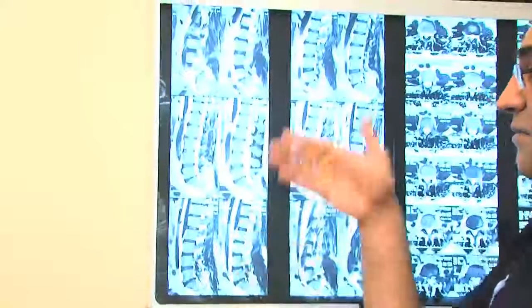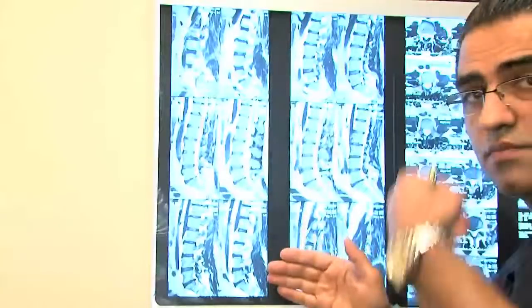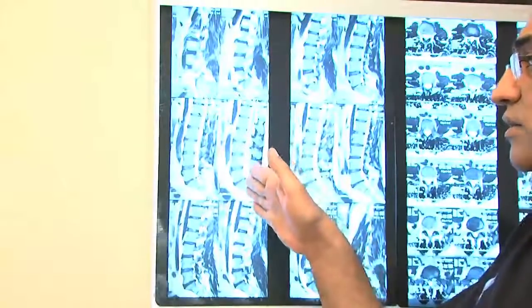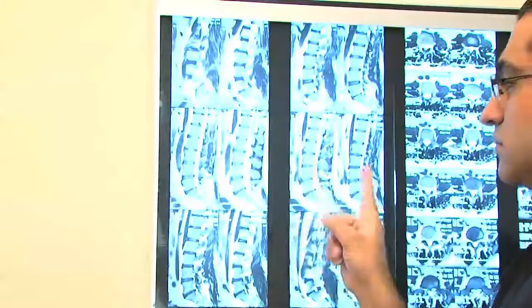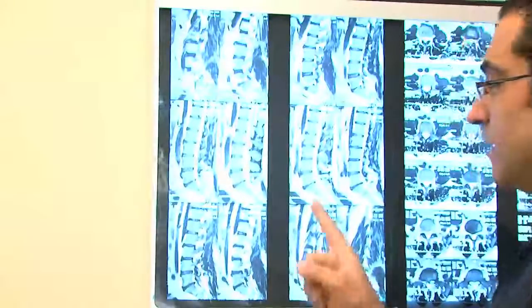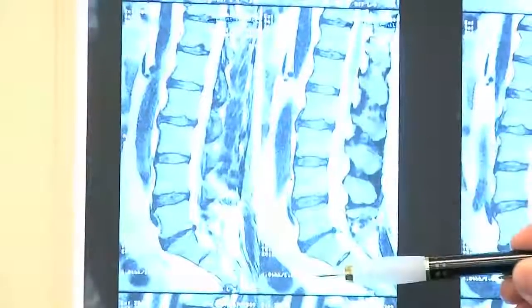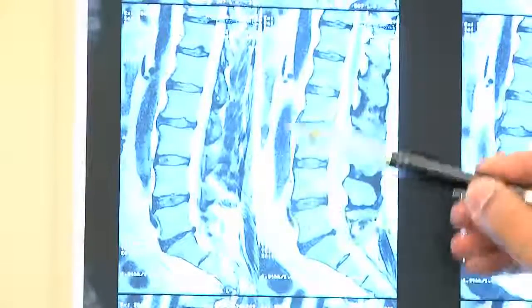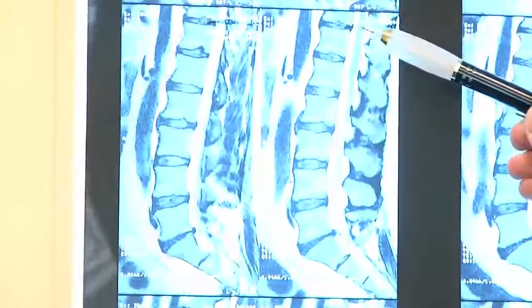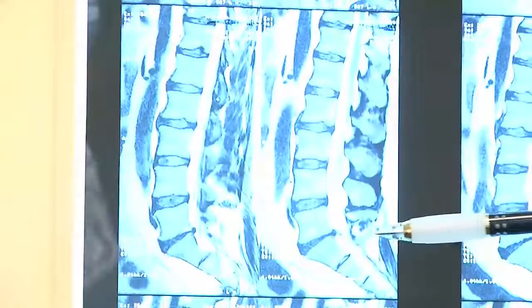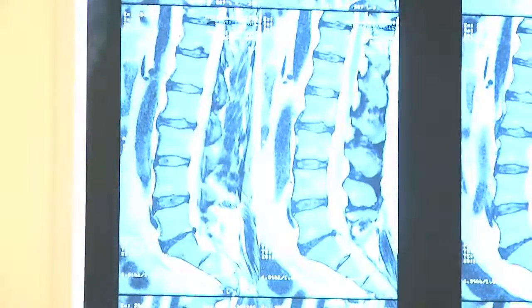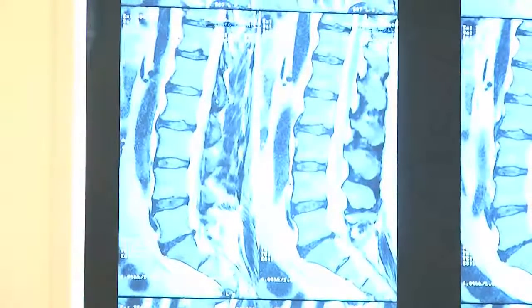This is an example of what we call a sagittal view. As you can see, the patient has been sliced right down the middle and you're looking from the side. The slices go from left, to middle, to right. Focusing on the middle picture: this is the spine, this is probably either the vena cava or aorta on top of the spine. This is the spinal cord that comes in and terminates right here, and these are nerves that come down and form the sciatic nerves.